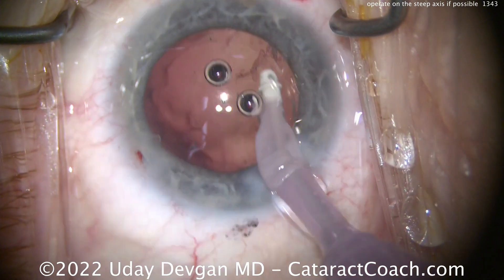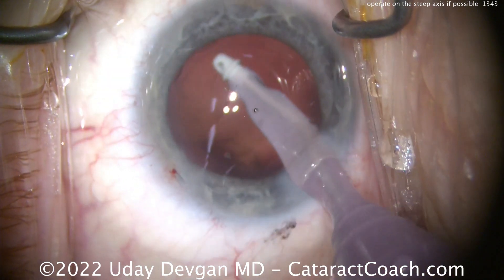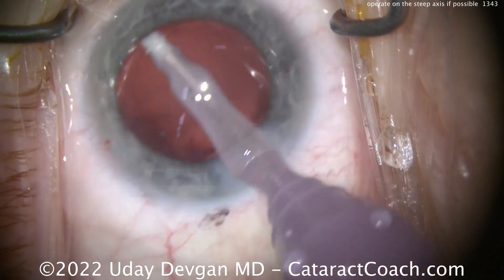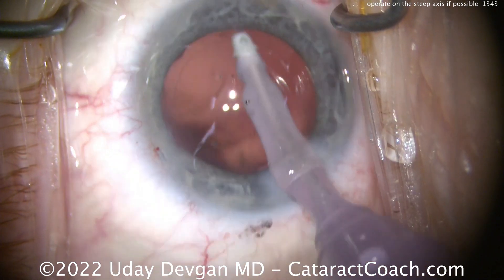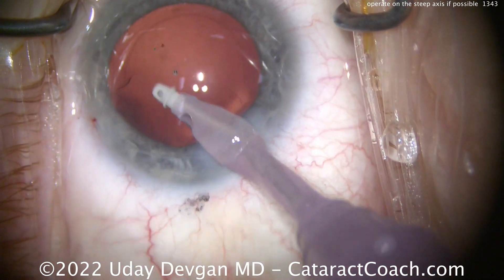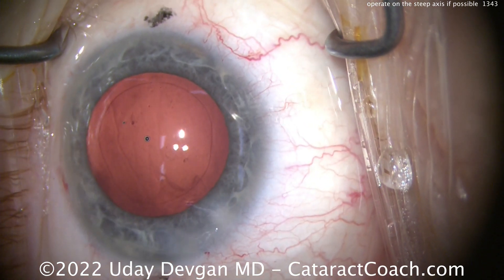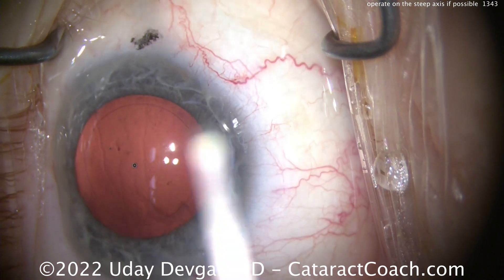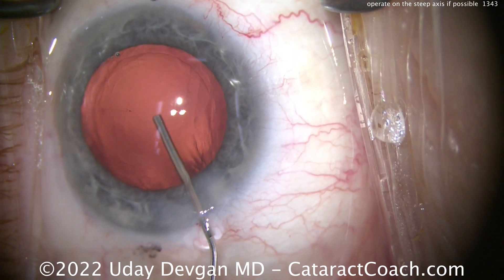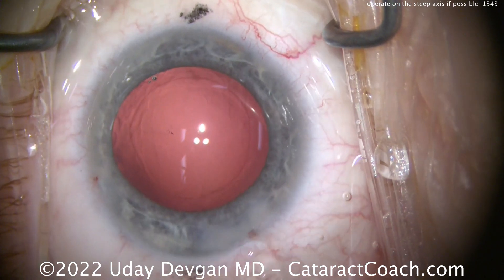You can see the black ink marks on the limbal edges — those are made at pre-op time at the zero and 180 degree marks. Capturing the bag nice and clean. It's very important, especially for US-based surgeons — patients really want a refractive outcome from their cataract surgery. If you're just learning, great, keep building those skills, but don't forget about the refractive outcome. That refractive outcome is not just spherical in terms of IOL power, but also astigmatic — so you really want to pay attention to that for every case.